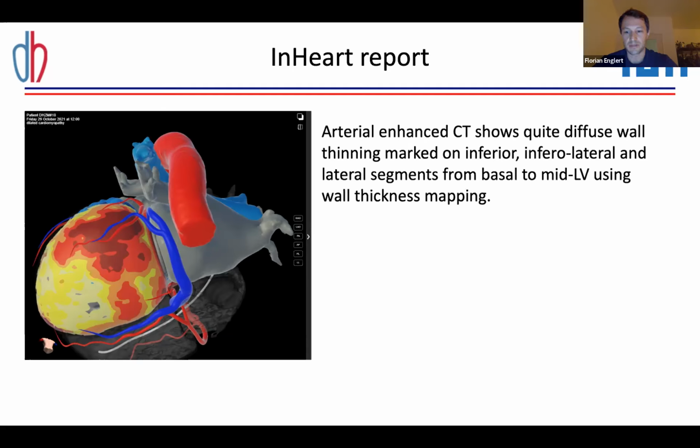Okay, good. And a last question: since the patient had undergone multiple prior ablations, why did you decide not to opt for an epicardial approach? Because, I mean, either epicardial or via the CS. We see that there's a CS branch, so that may be interesting to catheterize here. Obviously, you didn't have the VT, but yeah.